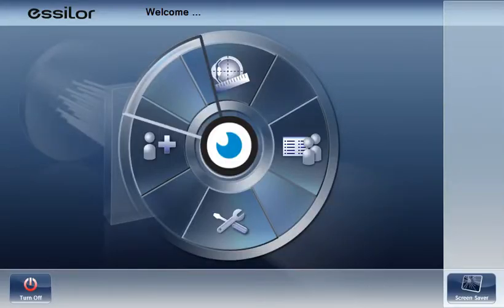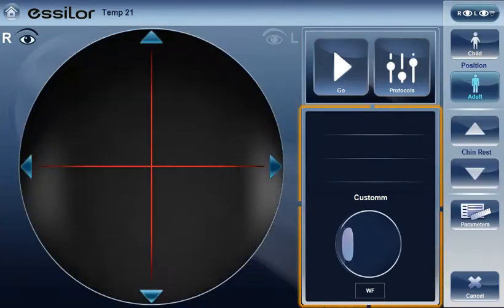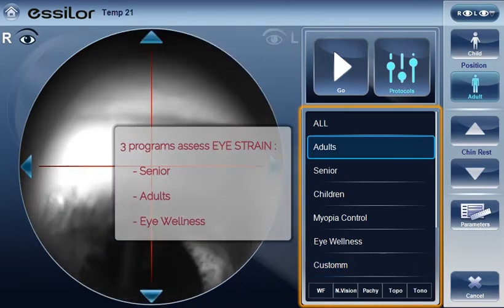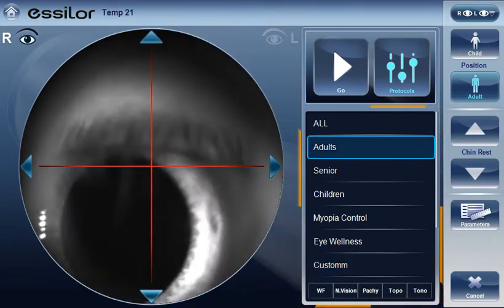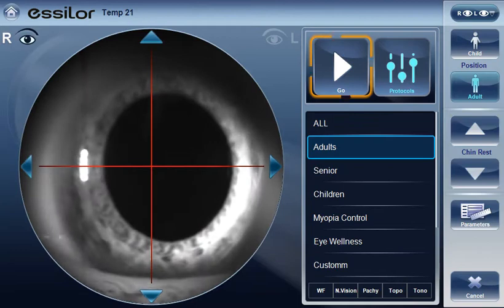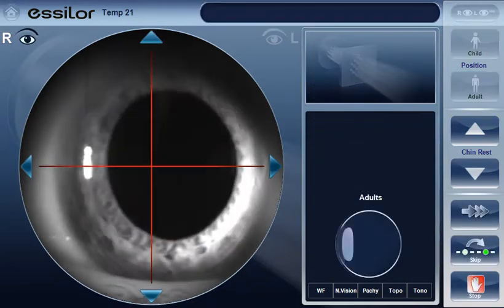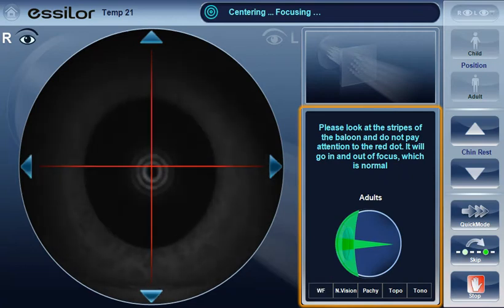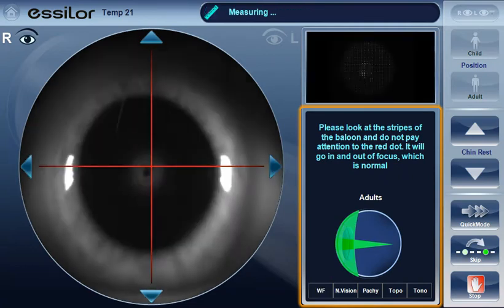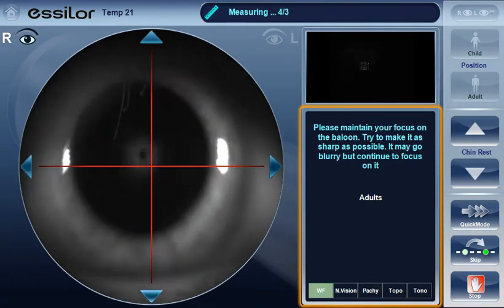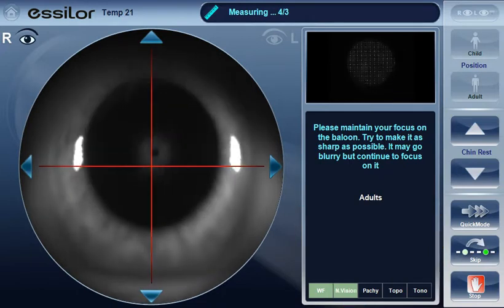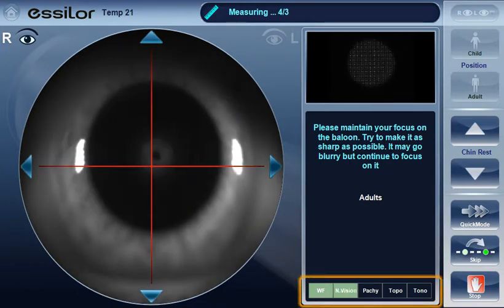You enter the main screen as usual, select the protocol you want to perform, install the patient as usual and start the measurement. You can notice a simplified user interface of the main menu, which includes a more detailed phraseology to guide the operator throughout the process. You can also follow the process on the bottom part of the screen.